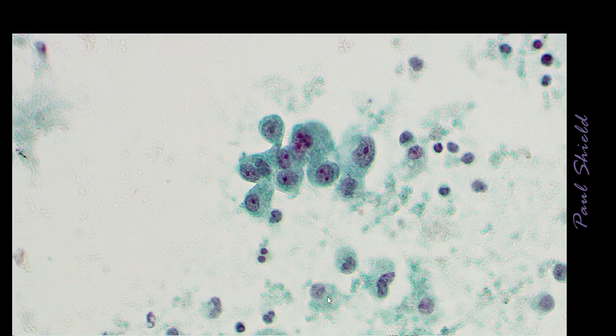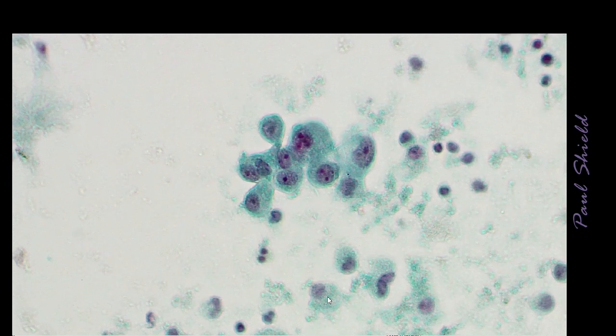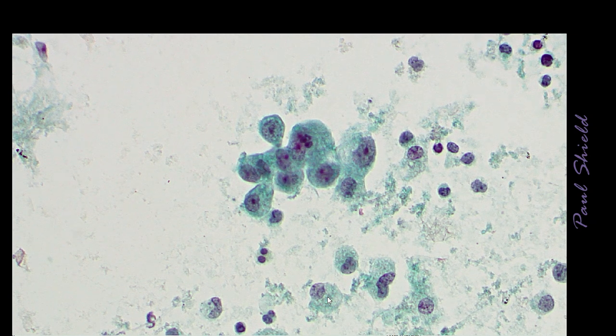cohesive. These guys have all got that prominent single central nucleolus. That's a feature of adenocarcinoma, and they all have eccentric nuclei as well. This is just another group.